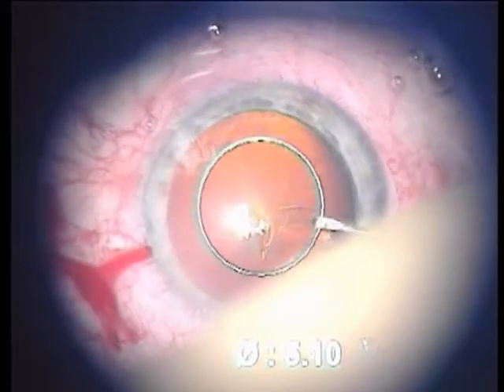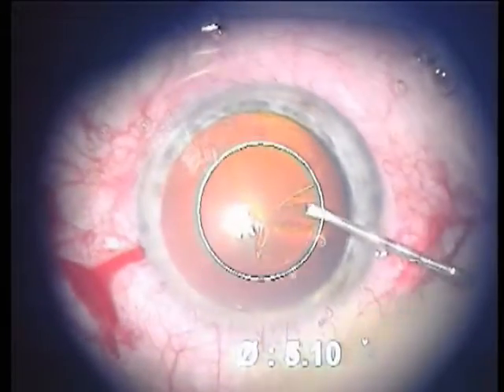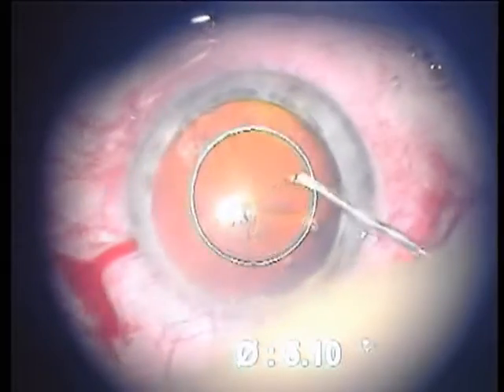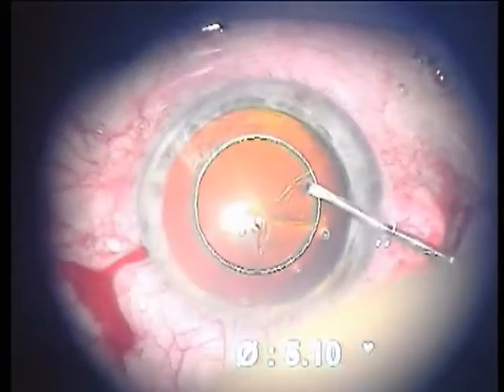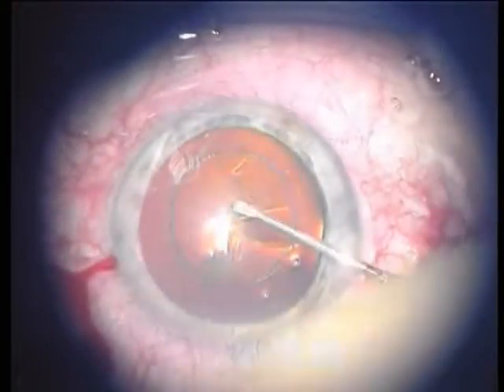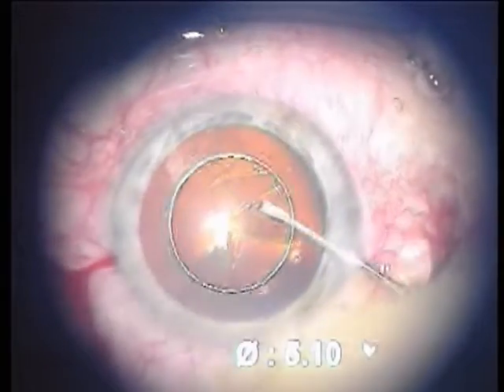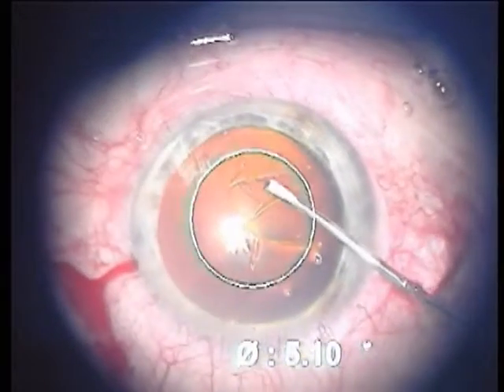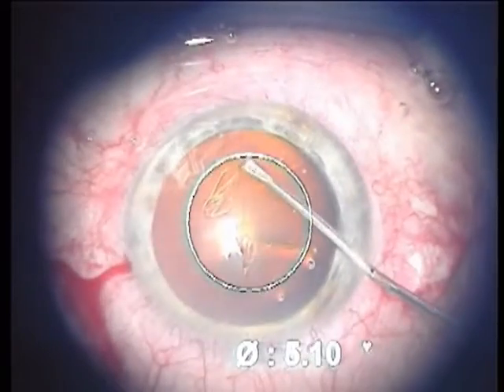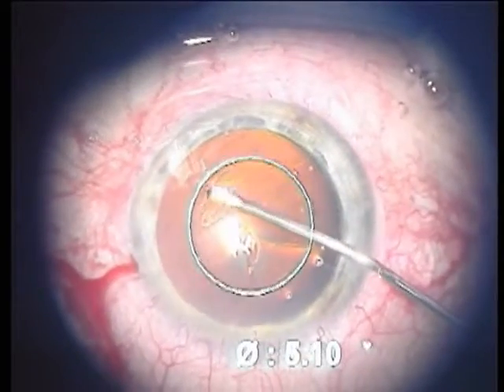The resultant image — in this case the circle — is shown on a reflective micro-display. An optically imaging system projects the circle into the observation ray path. It is then perceived by the surgeon as lying with the correct size in the surgical plane.